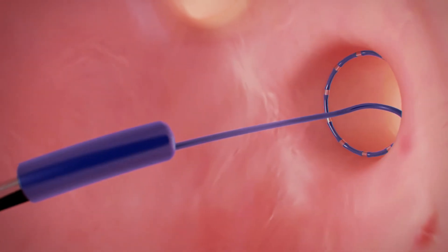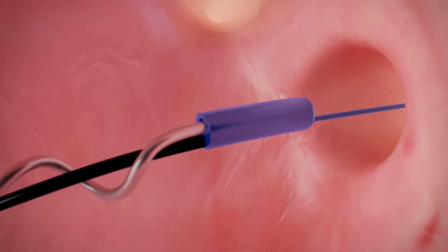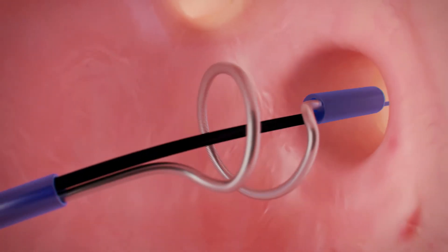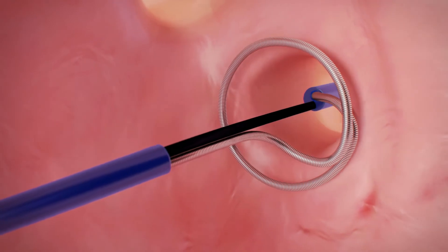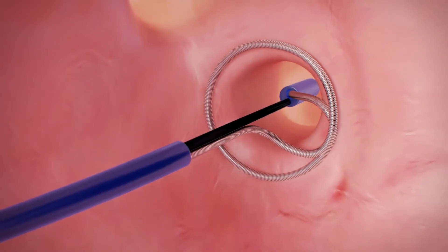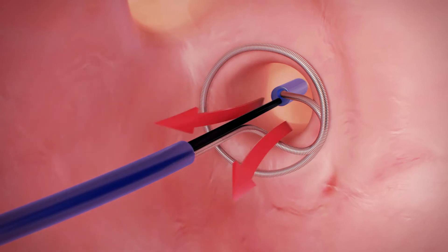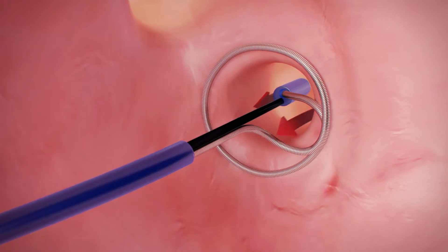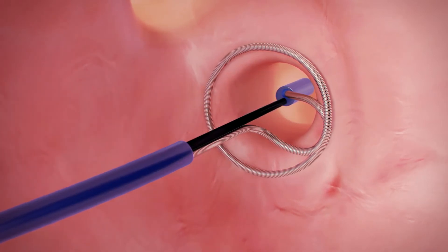Next, the Cool Loop catheter is set to its active configuration. The loop is then positioned at the pulmonary vein ostium. Blood flow is not interrupted because pulmonary vein occlusion is not required.